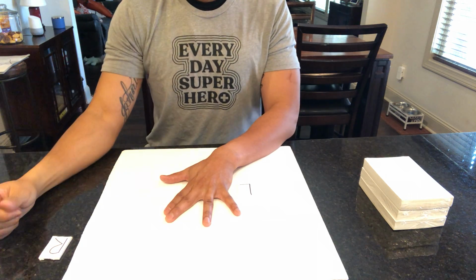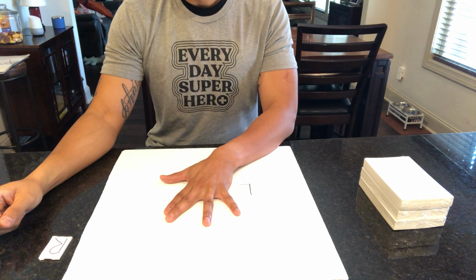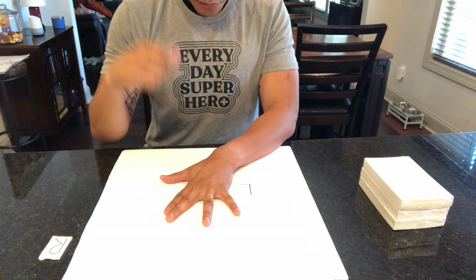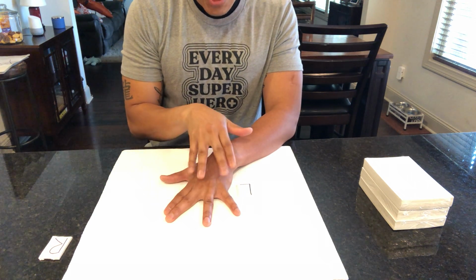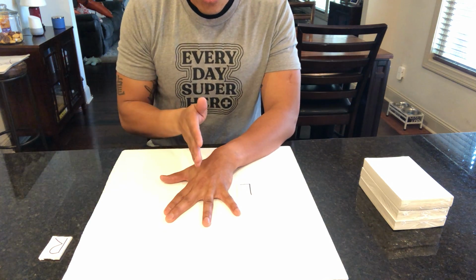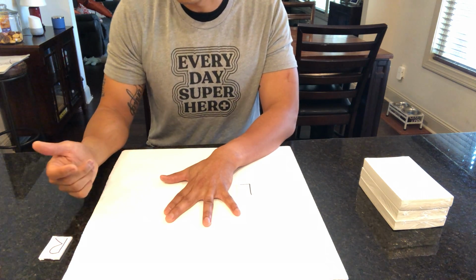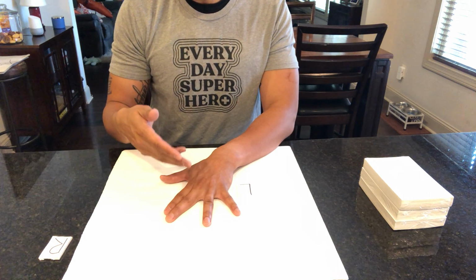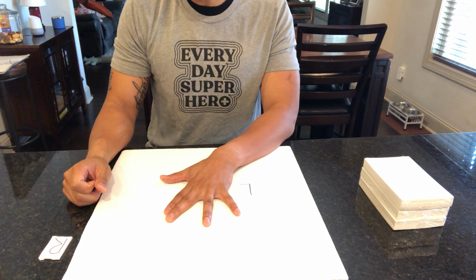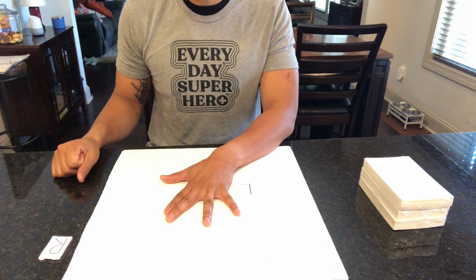As far as what we're looking at on the PA view, the central ray is going to be perpendicular to the PIP joint. Collimation should be as close as possible, isolating the affected finger here. And fingers should be parallel to the film plane. Affected finger should be parallel to the film plane. And what we're looking at is basically PA projection of the phalange, in addition to the articulations of the phalange and the distal end of the metacarpal of the affected finger. So this will be your PA projection.